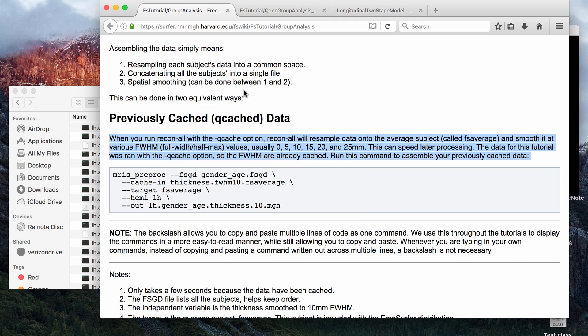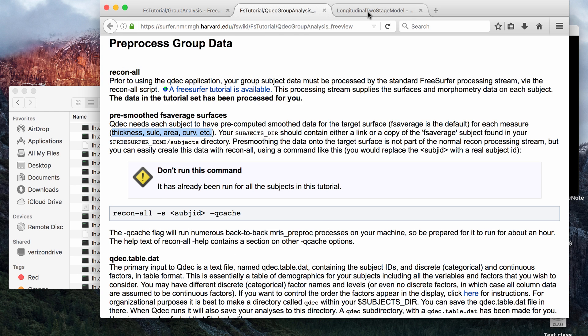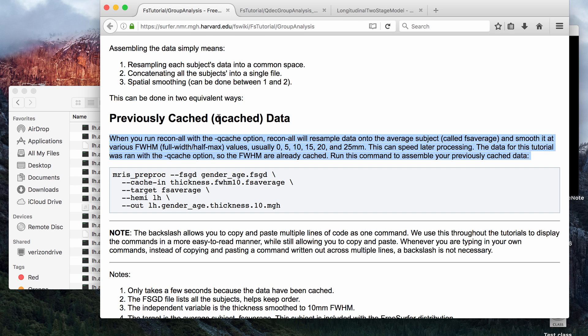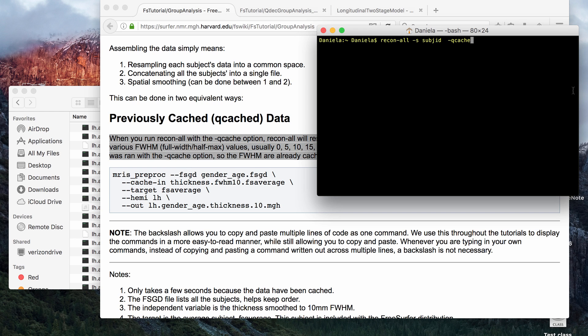The Qcache command doesn't have its own FreeSurfer page on the official website, but it is used a lot or mentioned a lot for any type of group analysis tutorials. I'll go ahead and put the links to these below. This is the main page where it talks about it, I think.